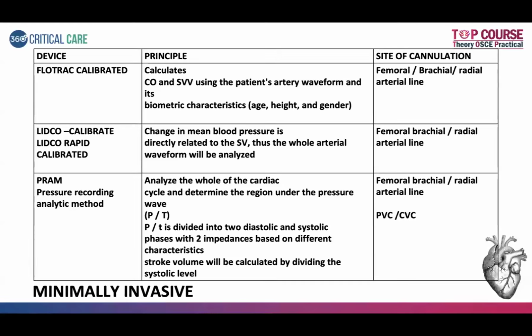Another technique is PRAM, the pressure recording analytic method, where it analyzes the pulse and divides it into a systolic phase and a diastolic phase by identifying the dicrotic notch. Based on the waveform characteristics, it tells us about the nature of the resistance it could see in the artery, and the cardiac output.